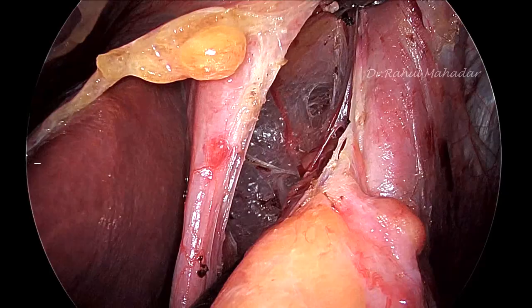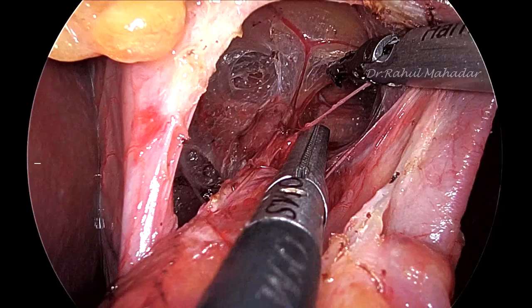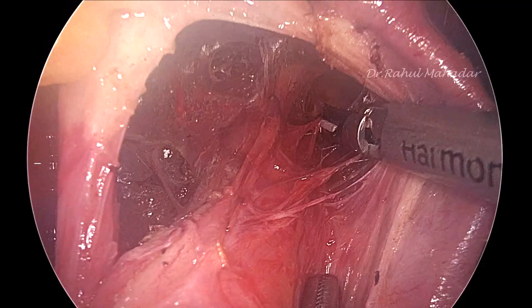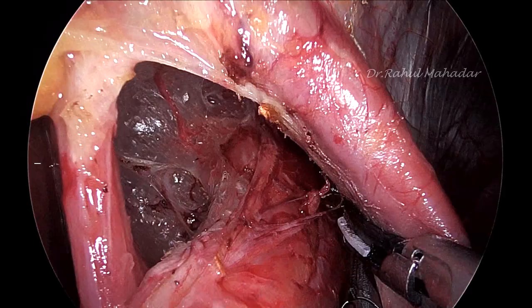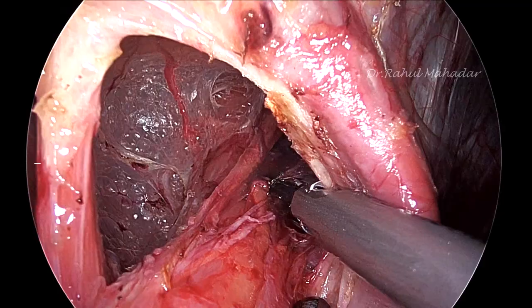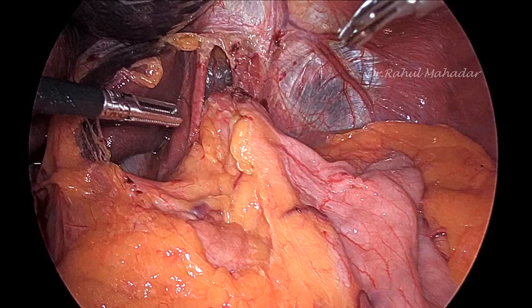So you are separating the lower esophagus anteriorly. While doing so, you have to see the vagus and not cause injury to the anterior vagus. There are small vessels here always. You have to cut these vessels with the help of the harmonic scalpel to avoid bleeding in this area. You can see the aorta posteriorly.